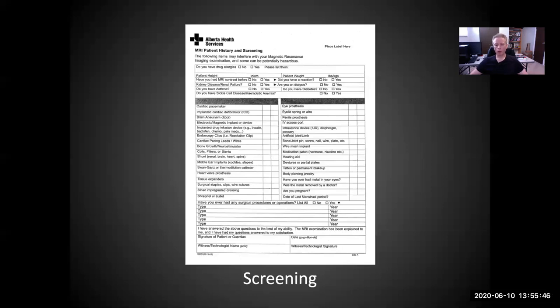So for men, we simply want to have it X'd out so that we know that these questions have been considered. We can't tell the gender by just looking at this form, so we want to know that this has been properly answered. In the case of women, we don't need to know the exact date of the last menstrual period. We want women to say whether or not they have any reason to believe that they might be late. And so it is sufficient to simply have it written in "recent."